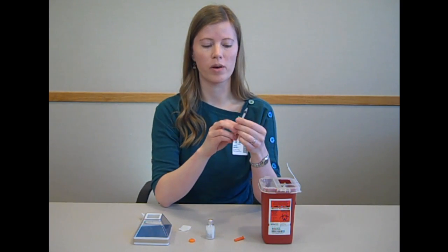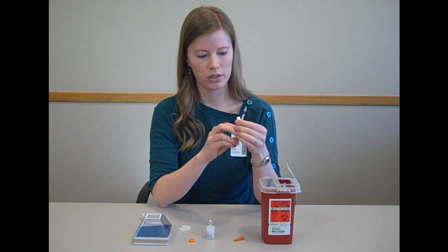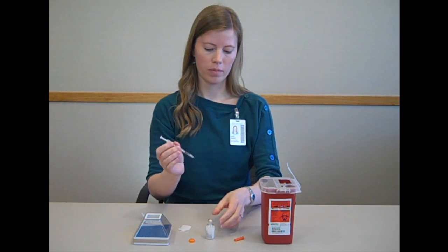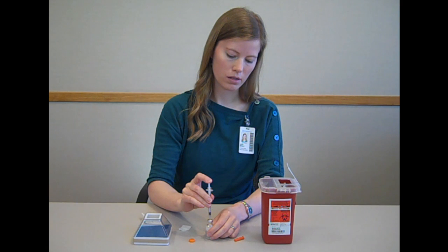Pull the plunger down to the amount of insulin that you intend to inject. In this case, I intend to inject 20 units, so I pull the plunger down to 20. Then stick the needle into the vial and press down on the plunger to inject the air into the vial.